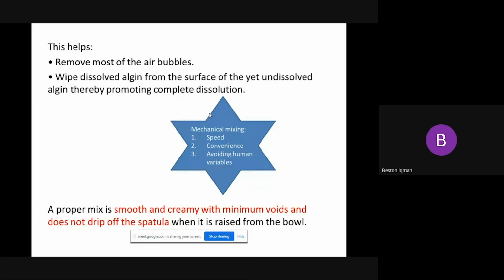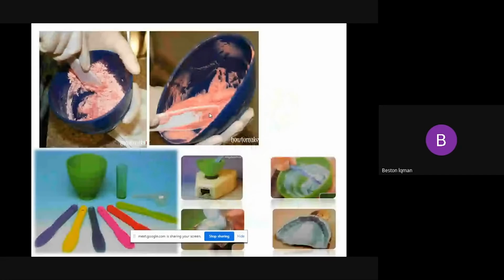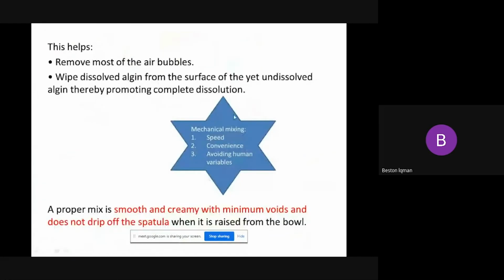We have sometimes mechanical mixing by the aid of a mixer. What is the benefit of it? It is speed, convenience, simple to use, and avoids human variable. What do you mean by human variable? Sometimes we can add more powder, or increase the rate of water, or increase or decrease the time of mixing. All of this is a human variable.